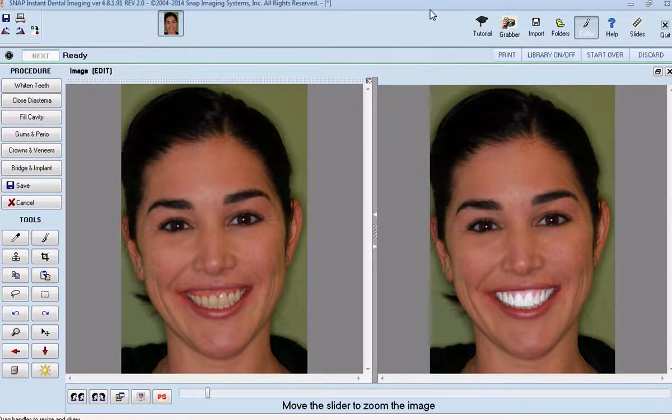In my opinion, it gives a lot more information than doing a wax up or anything like that. There are companies that will do this for you as well, but the downside is the patient doesn't get the same wow effect they do when they get to see this transformation in front of them. When you're doing cosmetic dentistry, there's a certain aspect of emotion involved, and they want to feel a connection between you, the dentist, the guy that's basically creating this smile. They want to know that you know what you're doing, and they really want to see you in action. So it's nice that you can let them see what you're capable of in such a short period of time.